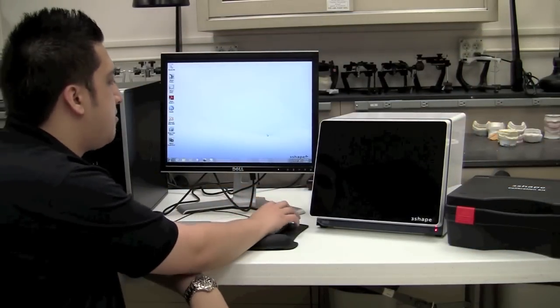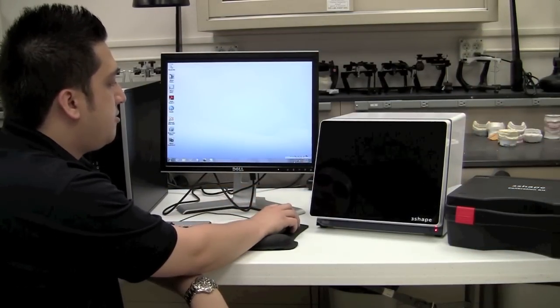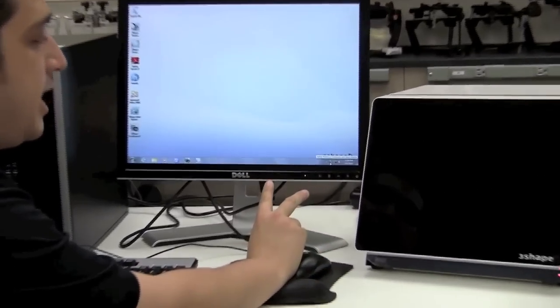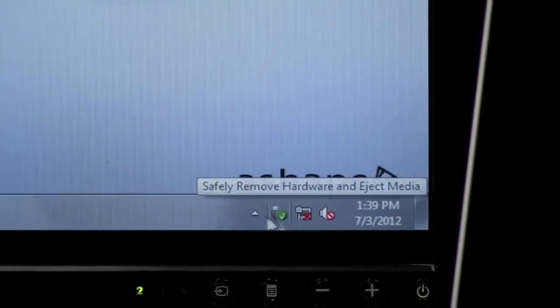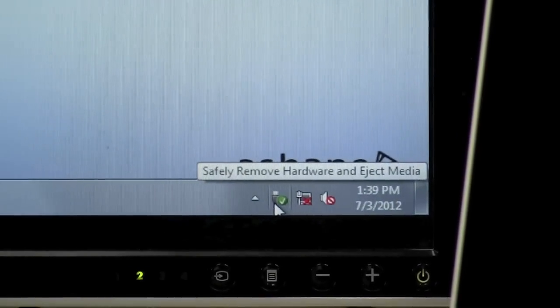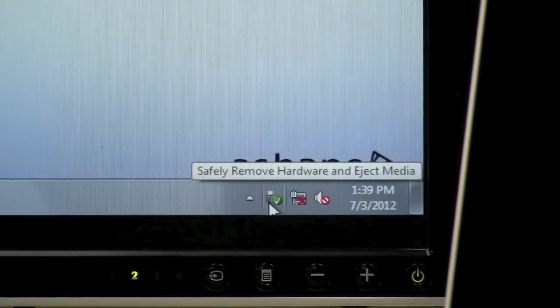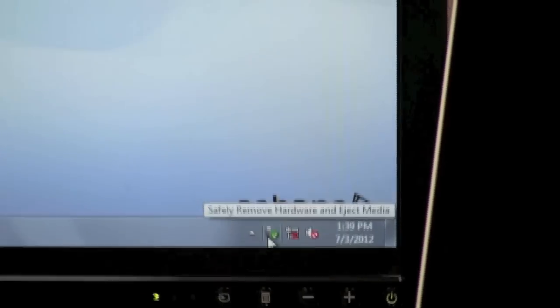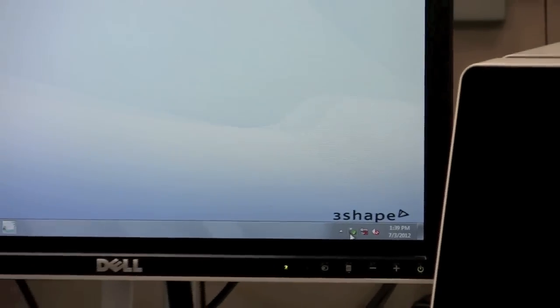Now that we've switched the power on to the back of the scanner, we should get a little notification down here in the bottom right-hand corner. You're going to receive one of two notifications: the first one is to safely remove the hardware and eject media. If you don't get that notification, then you should receive a notification stating that the hardware has successfully been installed, and this is a prompt to go ahead and proceed to opening up the 3-Shape Scan Server application.